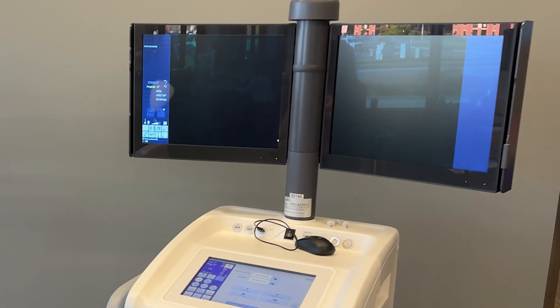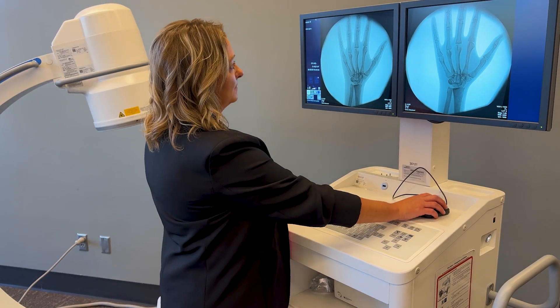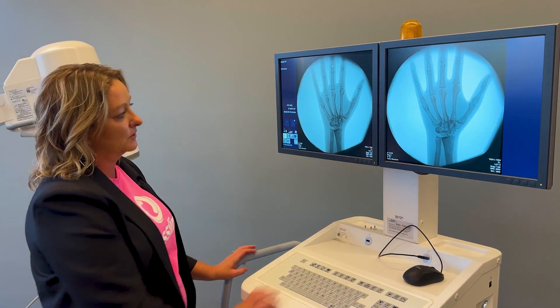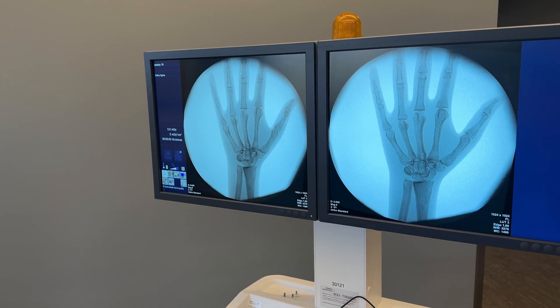The monitor cart has a touchscreen user interface. You have easy mouse controls, or you can simply rotate your image from the mouse if you're close to your monitor. Otherwise, you can do pretty much everything you need to do with your image during the procedure from behind your C-Arm.